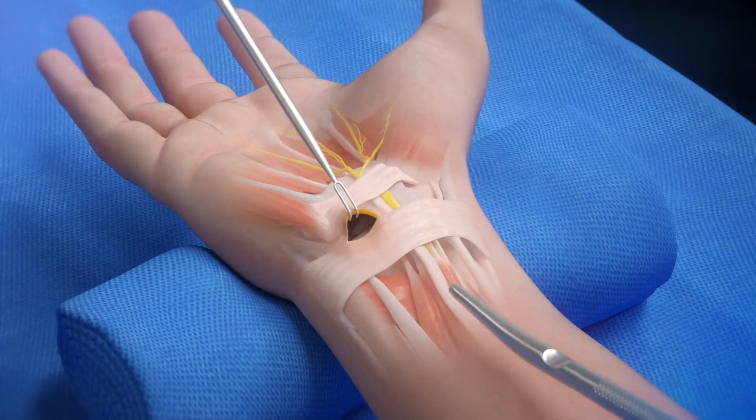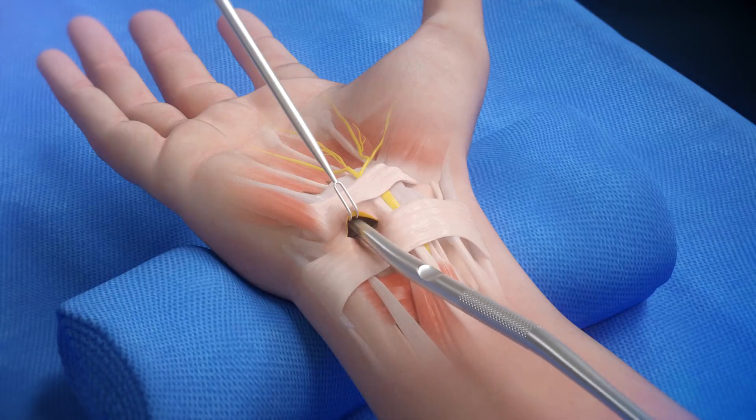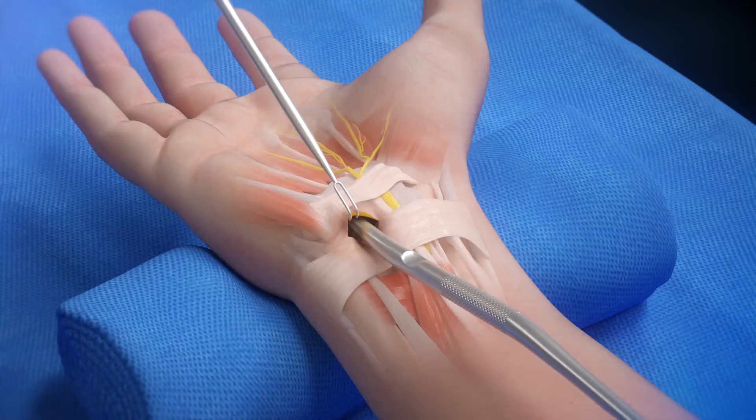Insert the dilator end of the double-ended instrument. Advance the dilator, hugging the hook of the hamate. Keep inserting until the far edge of the transverse carpal ligament.